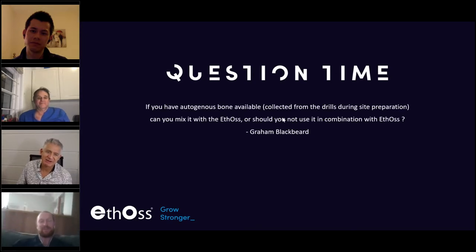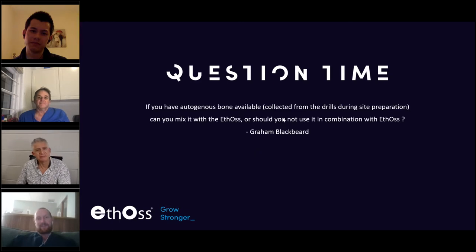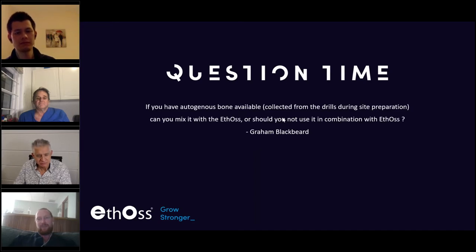I actually agree. Sometimes you can torque it very high. But in my humble opinion, I think it depends where you get the pressure. If you get it in the apical area, it's not a problem. But if you have it in the dense cortical non-vascularized area, it could be a problem. So you have to know your implant system very nicely. And if you are just thinking about this concept, I don't think you will have any problem. I like what you say.